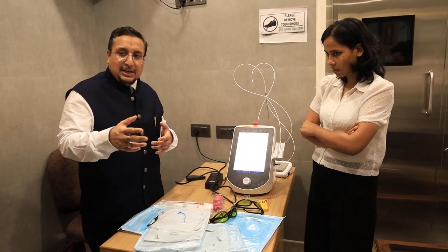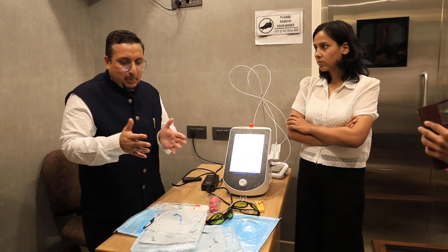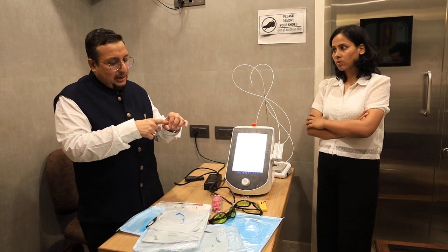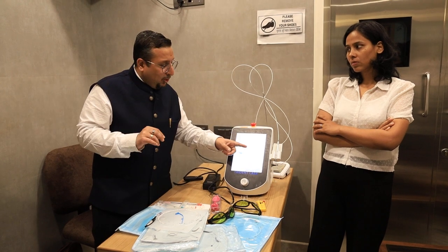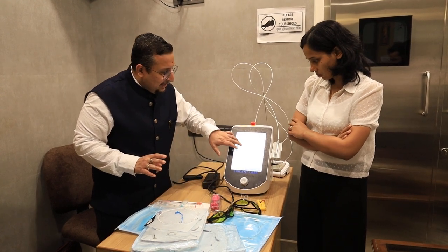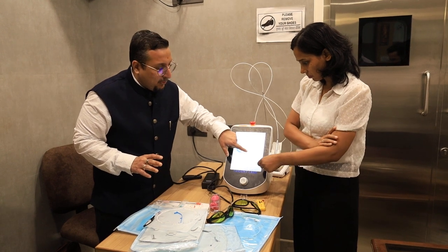When you are delivering the energy in the tissue, you have to see the energy here — it has to be calculated. All the surgeries we have done are calculated on energy basis. For piles, for example, in one pile mass we give 200 to 250 joules of energy. So in a single pile mass, you have to ask the assistant to tell you if it has reached 250 or 220 joules. The total joules of energy is calculated here. This is the emission time. Three main things you should know: one is the power, one is the continuous or pulse mode, and second is how much wattage you are giving.